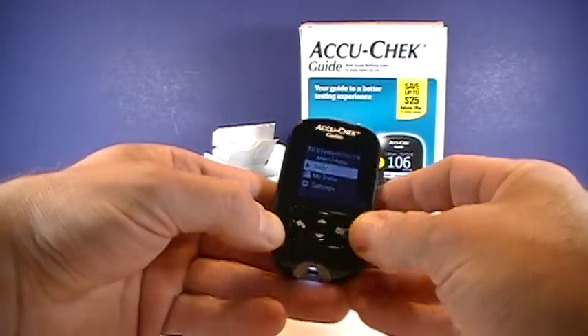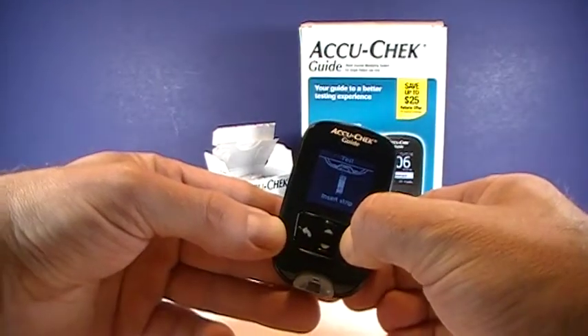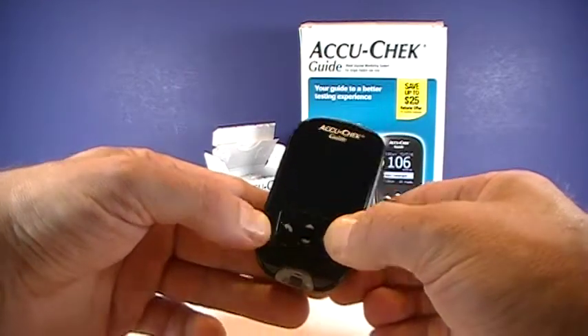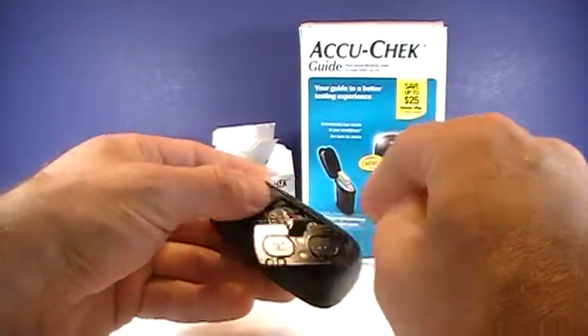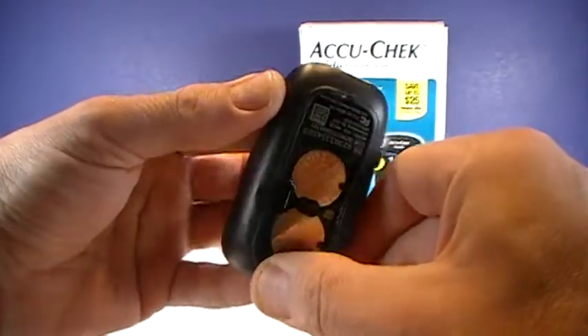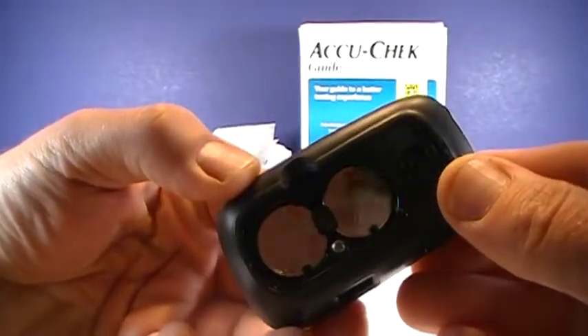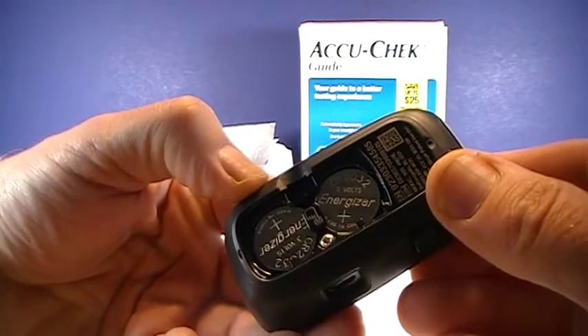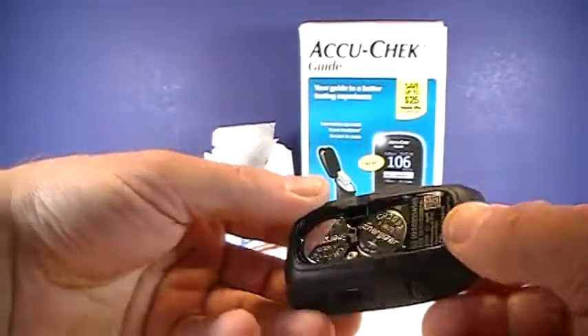Right there, if you wanted to test — it's prompting you to insert a test strip. If you're done, you can just hold down the OK button, and it shuts down. Again, that takes two 2032 batteries. 2032 you should be able to find at most pharmacies, as well as most hardware stores.